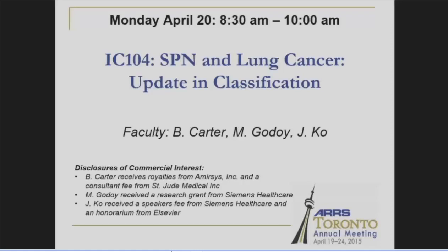Regarding your question, we have to be very cautious when we see those retrospective lesions. One thing that we could potentially say is barely identifiable previously. I don't know if you guys have other suggestions. There are sometimes where if something hasn't been called before, I will actually just say there is a nodule measuring X, and will not throw the person under the bus who came before me who didn't talk about it. And then once I do that, I'll call the clinician and alert them to what's going on. So if they do go back and look at the previous ones, then they have a heads up in that regard.